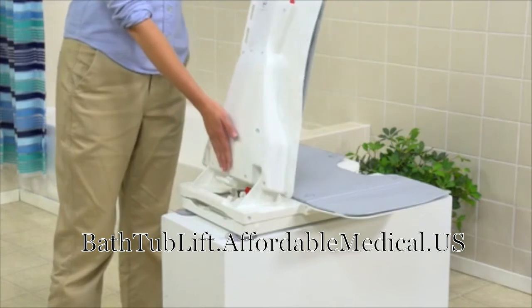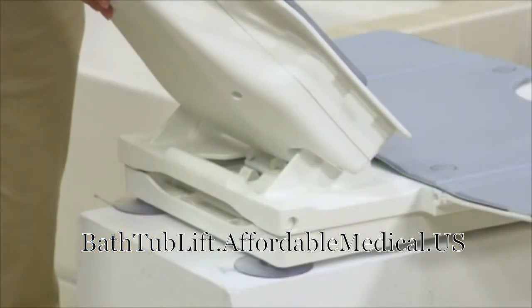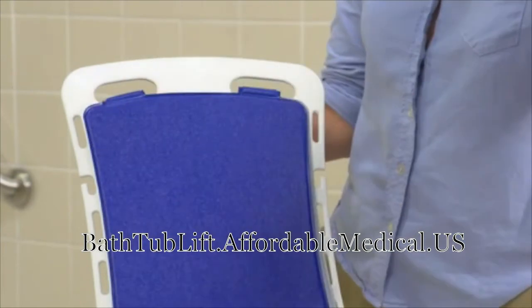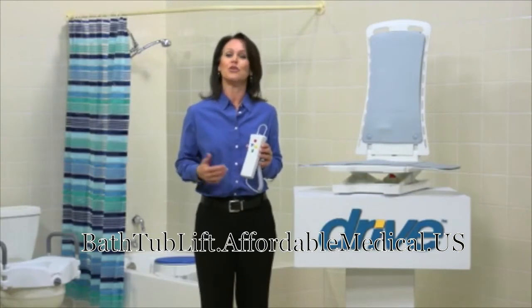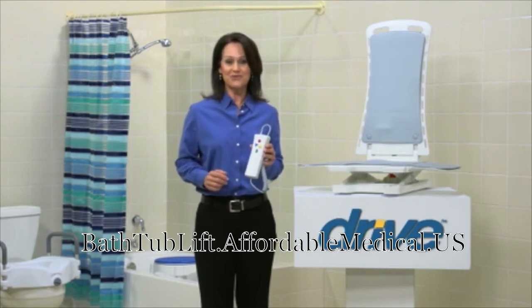The Bella Vita's slim profile enhances the bathing experience. Its lightweight two-piece construction and folding back makes disassembly, transport, and storage simple and convenient. Washable, hygienic seat and backrest cover sets are available in white, blue, or gray to match any bathroom decor. You can always count on Drive Medical to bring you convenient and innovative lifestyle solutions, now and for the road ahead.